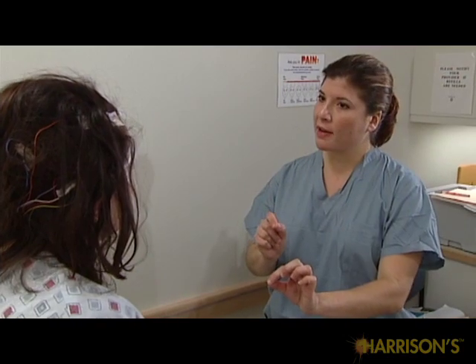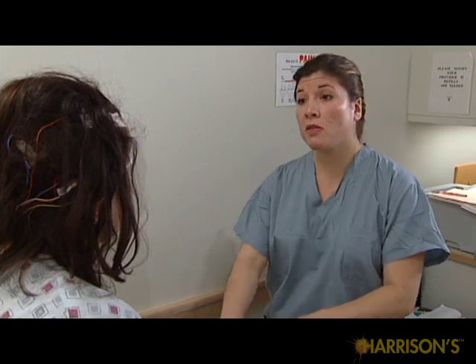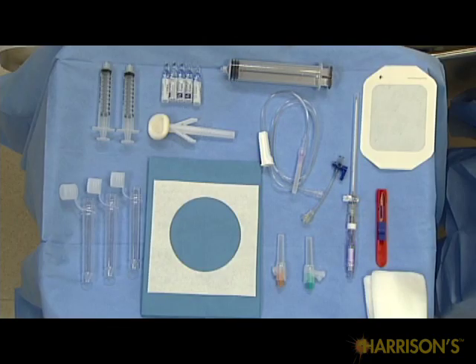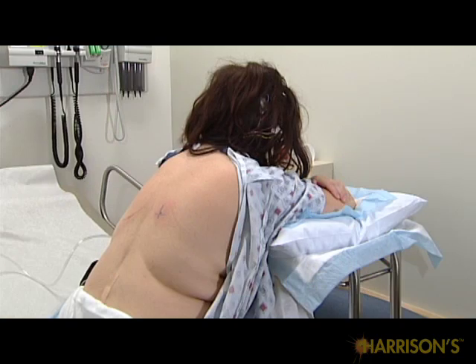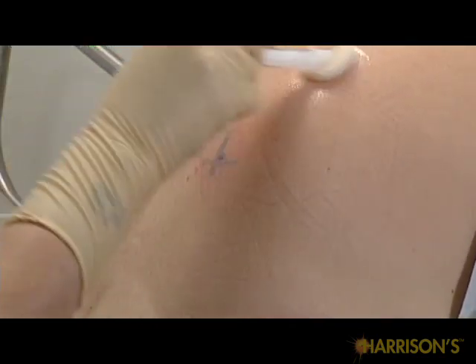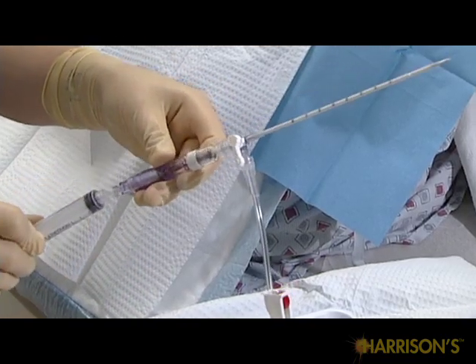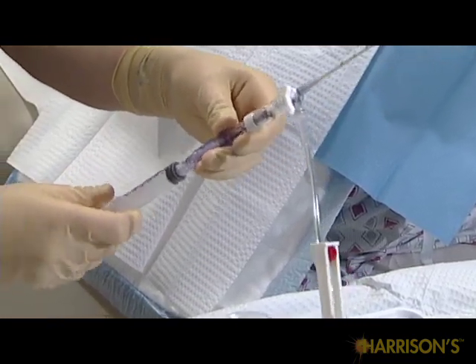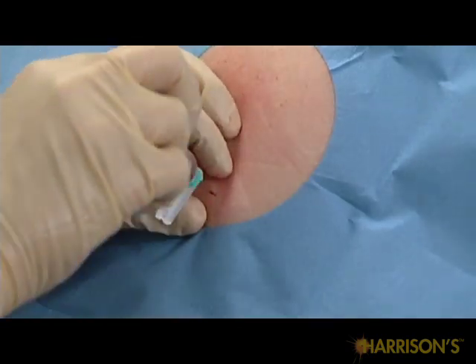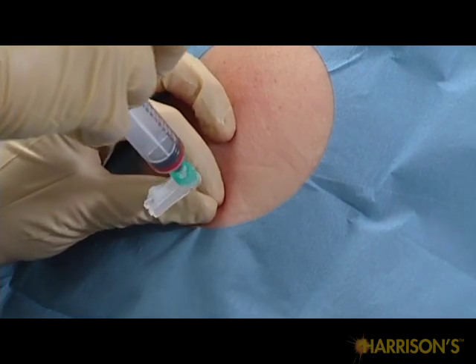To review, critical steps for thoracentesis are the following. Elicit key features of the history and physical that may predict difficult thoracentesis. Assemble equipment. Position patient properly. Prepare the site in the usual sterile fashion. After anesthetizing the local tissues, connect your stopcock and syringe. Enter the pleural space and administer additional anesthetic.